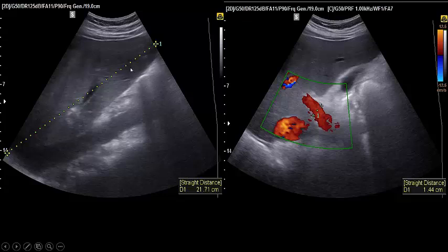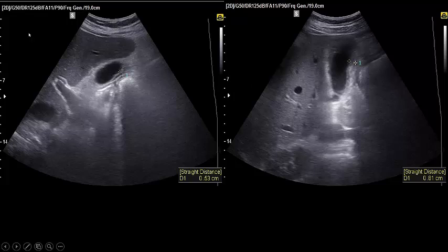The liver really is markedly increased in size, 21 right lobe, and the portal vein is dilated, but with very good antegrade flow. It's not retrograde flow, so against portal hypertension, and no signs of cirrhosis really. Smooth liver here, but it's a cardiac element, congested liver. But in the gallbladder here, you see the wall is edematous and thickened, in some areas reaching 8 millimeters. More than 3 millimeters is too much thickened. So the gallbladder here is markedly thickened, and there is hyperechoic mesentery all around here, denoting inflammation.